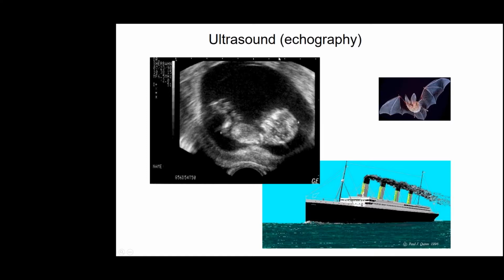It uses sound at a very high frequency. So it's a mechanical wave, a mechanical vibration. In that way, it's similar to what bats use to check their surroundings. They emit sound, at a frequency above what is audible by the human ear, and then they wait for the echo. Depending on how long it takes for the echo to return, that is how far the obstacle is.